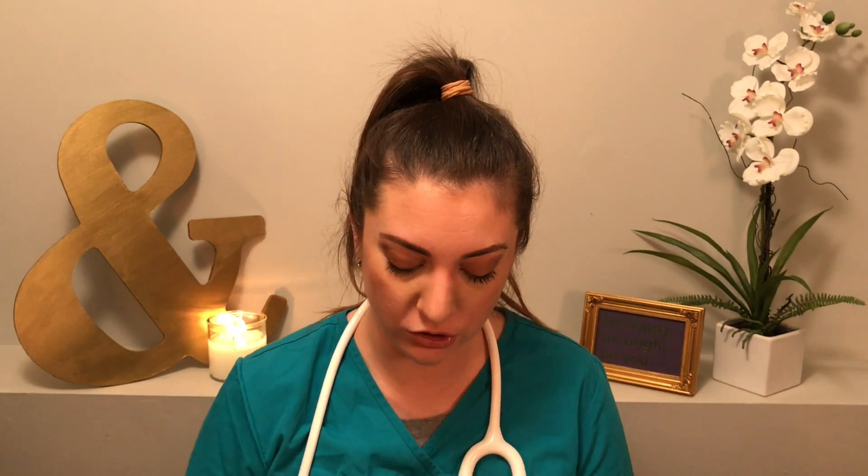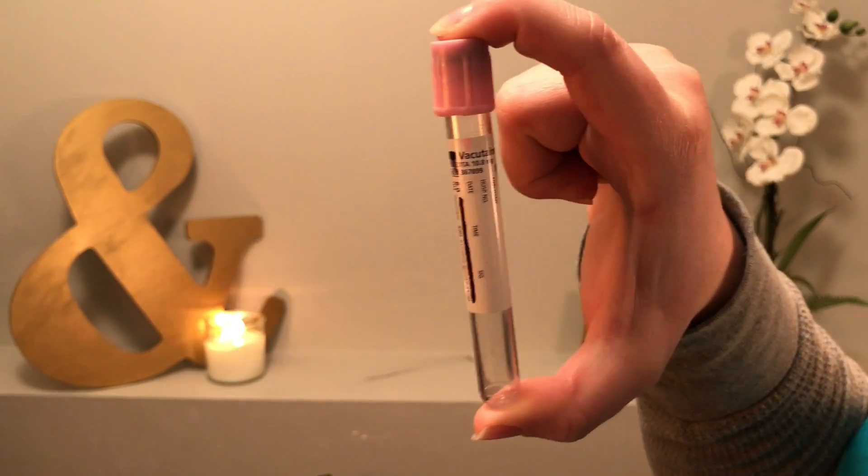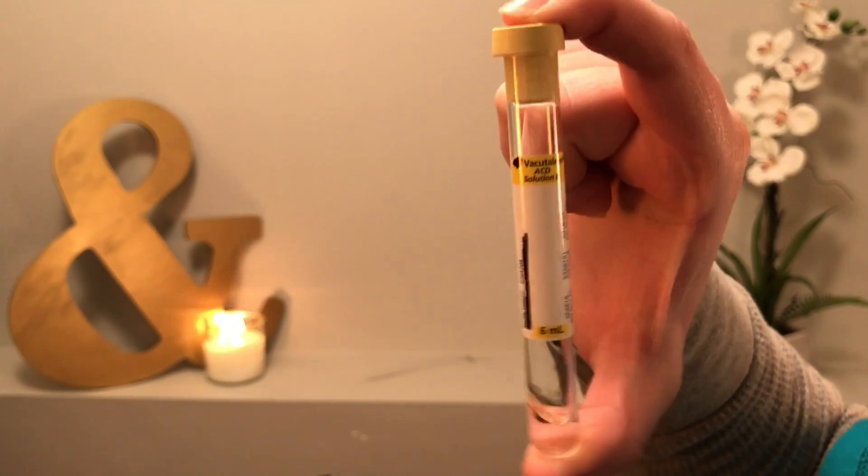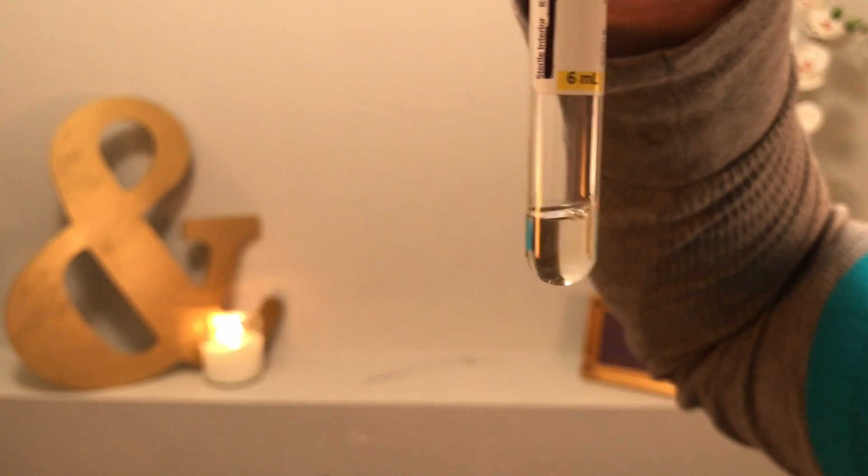Next we've got the pink tube, which is actually called the blood bank K2 EDTA tube — quite close to the purple tube. What this one does is check for blood types; we also call it ABO RH. It just checks what letter of blood you have — A, B, O, or AB — and then the RH factor, which is a positive or a negative. The last tube on my list is a yellow tube, also used for blood typing. The difference is that the yellow one has ACD solution B in it.